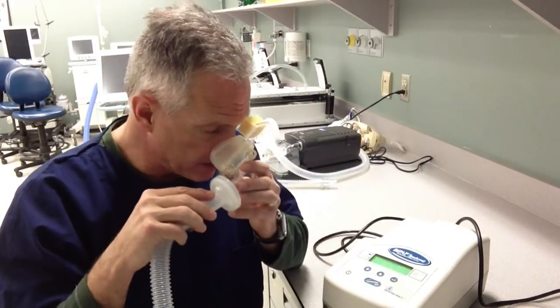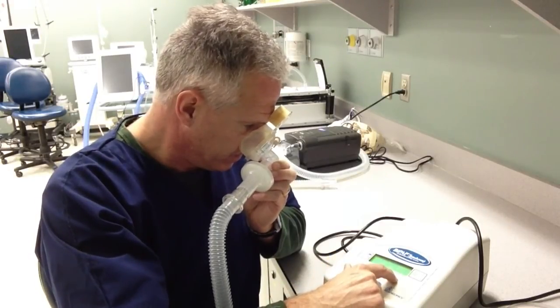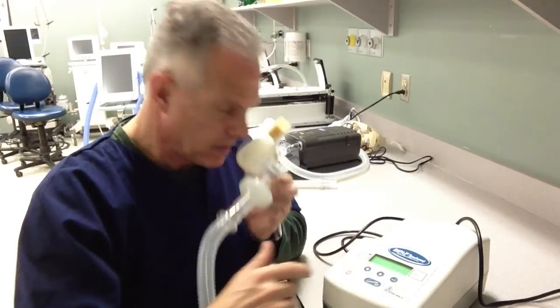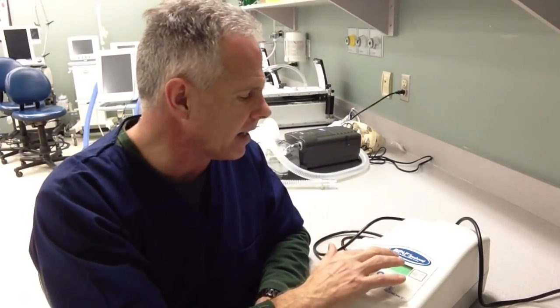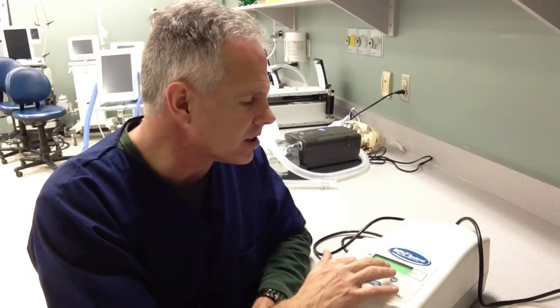Once it's on my patient, it'll pick up their own inspiratory efforts and start delivering the pressure support ventilation. Once you have it on your patient and they're spontaneously breathing, you can cycle through and watch it deliver the IPAP and EPAP. It doesn't give you a waveform, but it shows you a little indicator when they're receiving the inspiratory pressure, so you can see that it's synchronized with your patient. You can also cycle through the different pages to monitor the patient's tidal volume, minute ventilation, and respiratory rate.